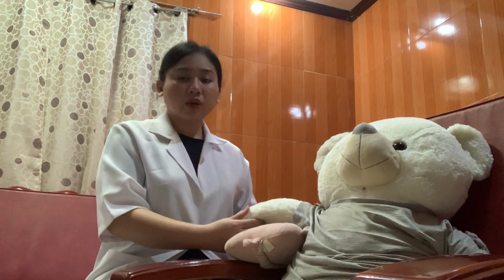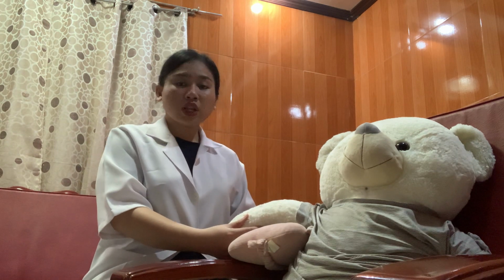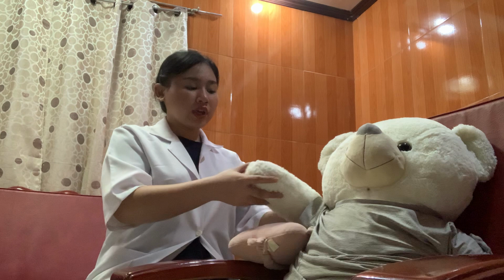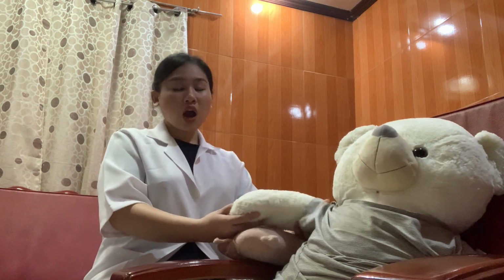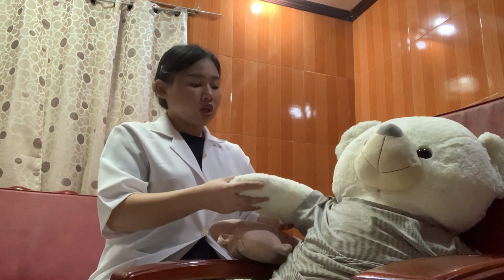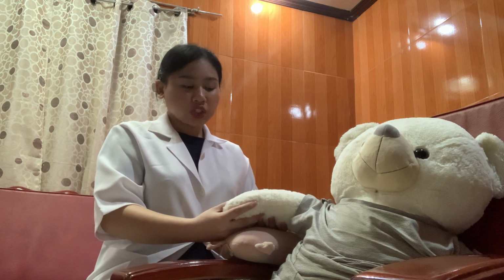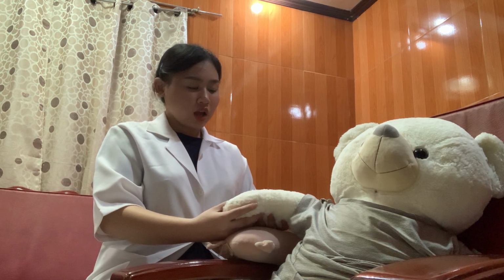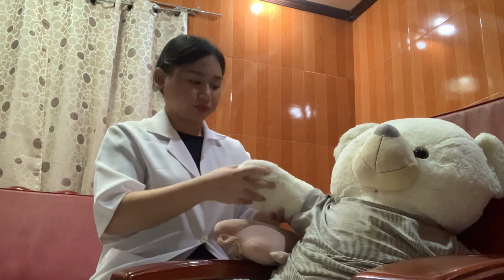For the brachial artery, we also use a semi-recumbent position. We elevate and hyperextend the patient's arm until the pulse is palpable, and then rotate the patient's arm until the pulse is also palpable.